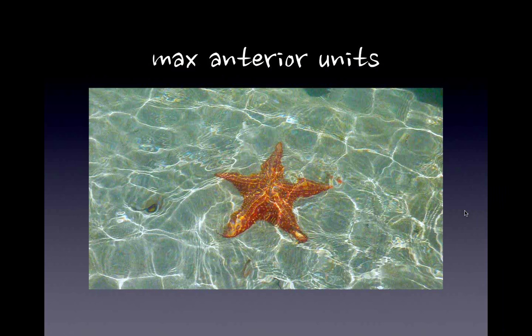Are you ultimately going to crown that central? Yes, the root canal, we're going to ultimately crown it. If so, are you using all ceramic crown? And wouldn't a fiber post be better? Well, if you take a fiber post in your hand and try to break it, it breaks. So I don't use fiber carbon because it breaks in your hands. If you use a steel post, you can't break it. So I want something strong. I'm not worried about the color. I'm going to block that out. A lot of people talk about fiber carbon. I don't use it because I want something that's not going to break.